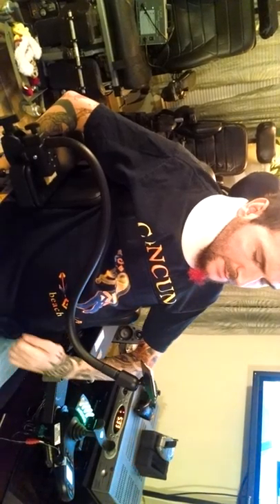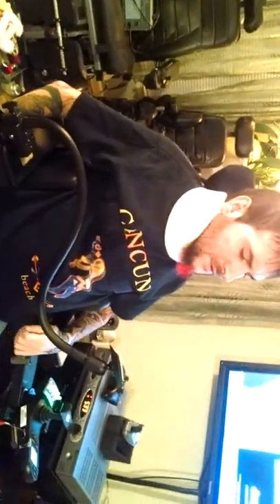I'm in the Permobile C500. I had surgery on my neck, so that's why my voice is all crazy.